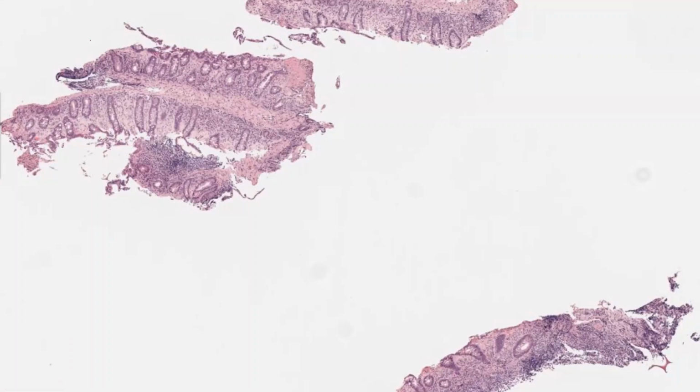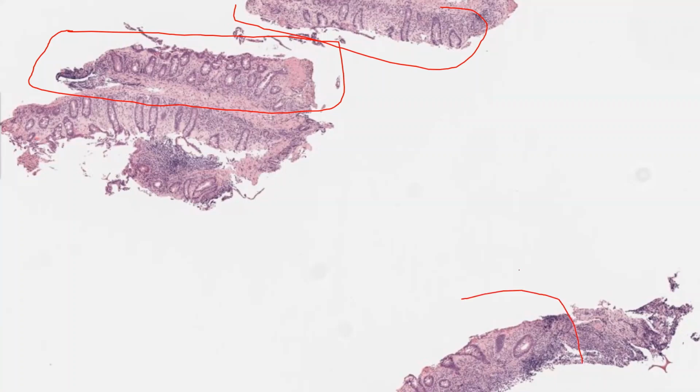Let me take them box by box, because some of you are saying focal. Tell me about the gradient of inflammation. Is it getting heavier as you go down, or is it getting lighter as you go down? Look at the gradient of the inflammation and tell me. Now apply the gradient for all four fragments of biopsies. Here, there, and there. What do you think of the gradients? It's getting heavier, exactly, it is heavier.